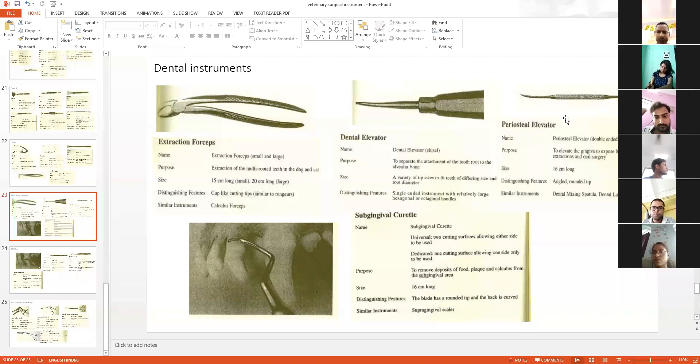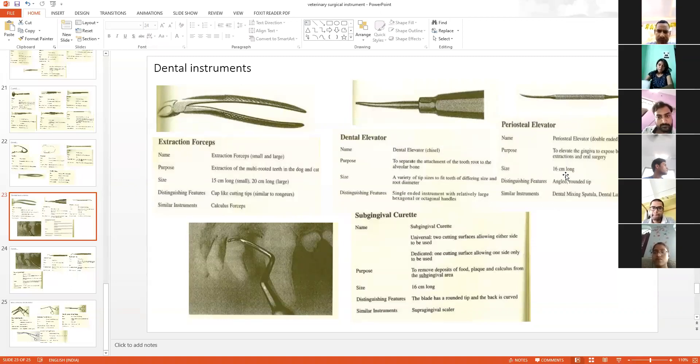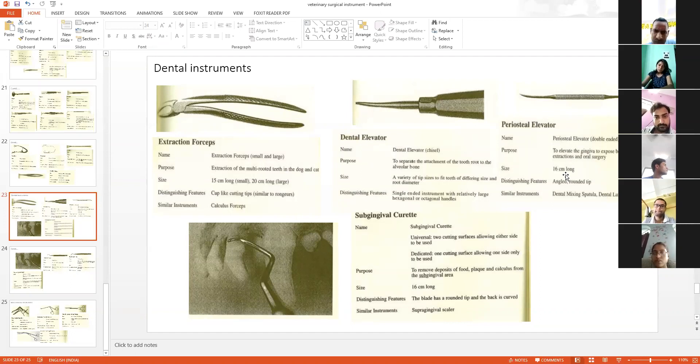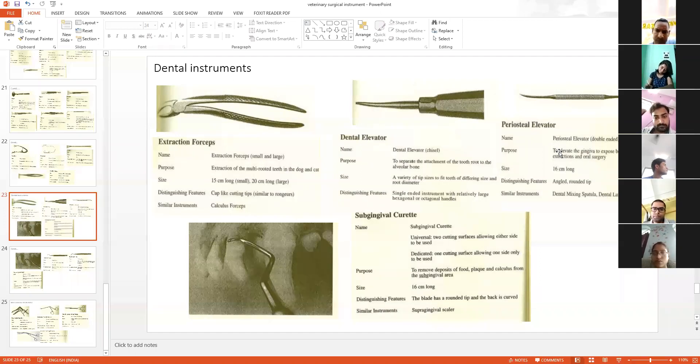This periosteal elevator is used for the elevation of either bone or gingiva. For the elevation of these structures, we use this periosteal elevator.